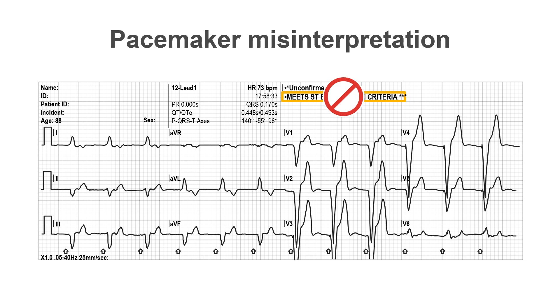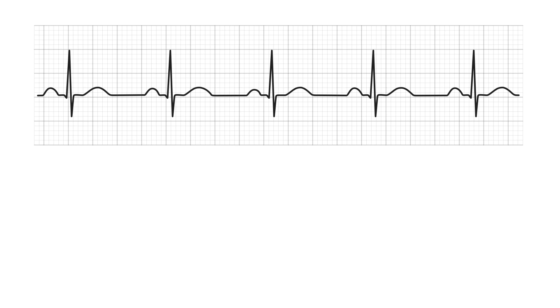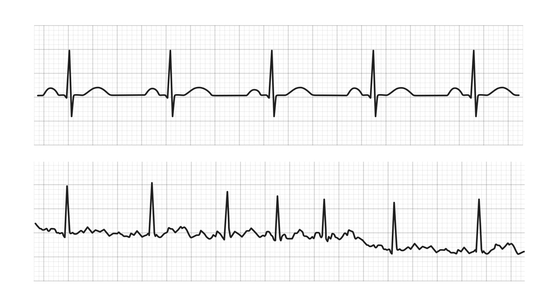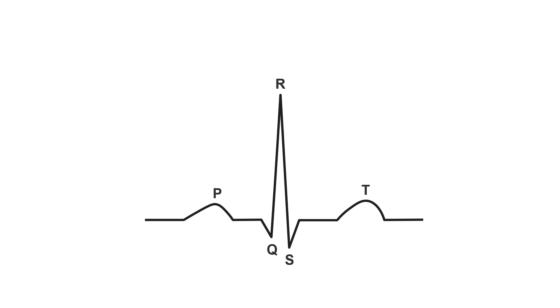So at the start of the Holter recording, what is the patient's baseline rhythm that you see? Is it normal sinus rhythm? Atrial fibrillation? Is there a bundle branch block morphology, or is the QRS width normal? It will be important as you review the ECG to note any initial abnormalities.